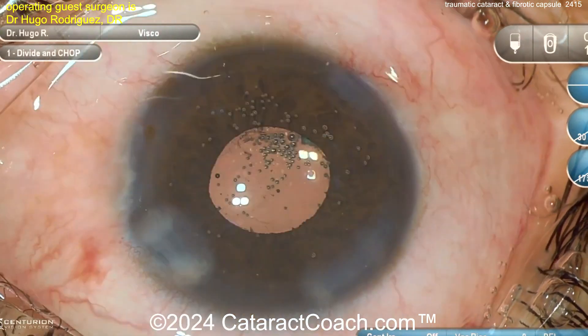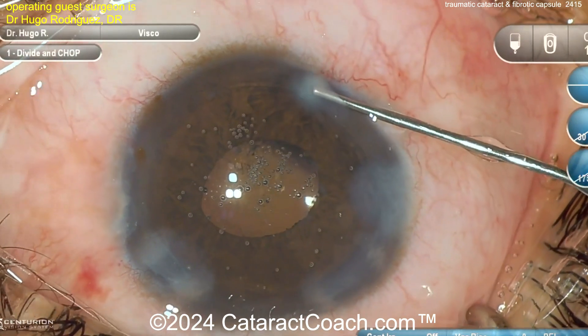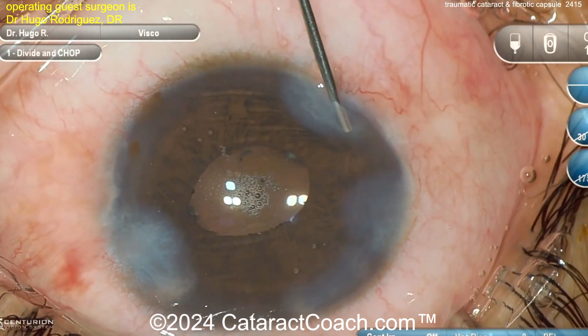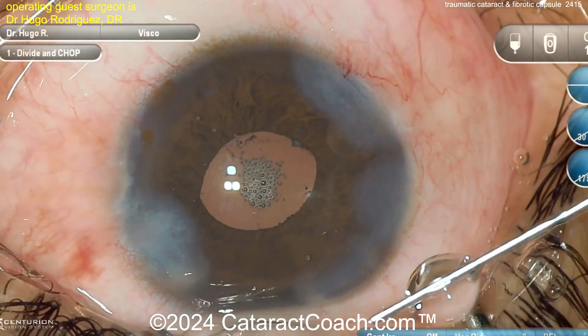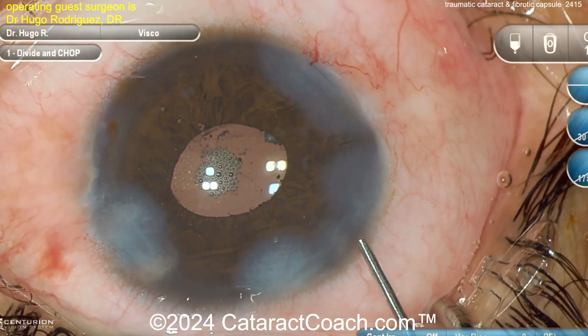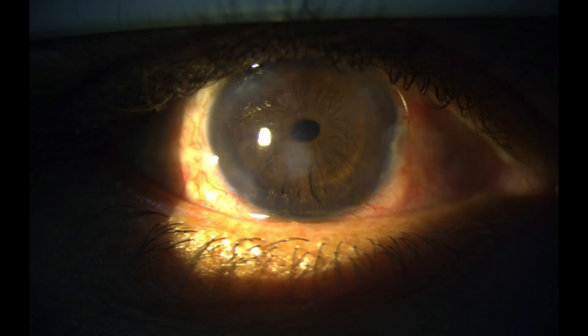Here we go at the end — sealing up the incisions. Look at that, that's a beautiful case. This patient is going to be pretty happy: started off with basically no vision and is going to end up with very good vision. Fantastic result from this traumatic case. Really proud of this surgeon — you did a beautiful job on a tough, tough case, and I like how you addressed that fibrotic lens capsule.